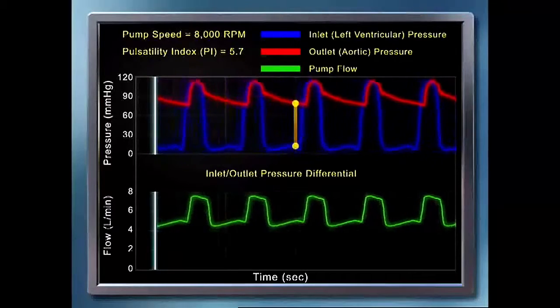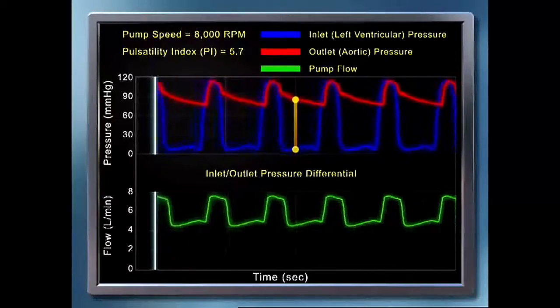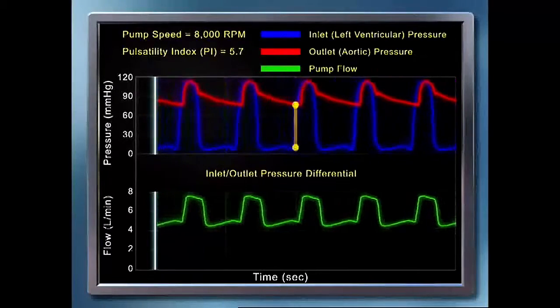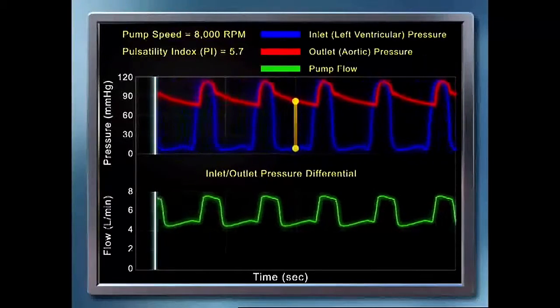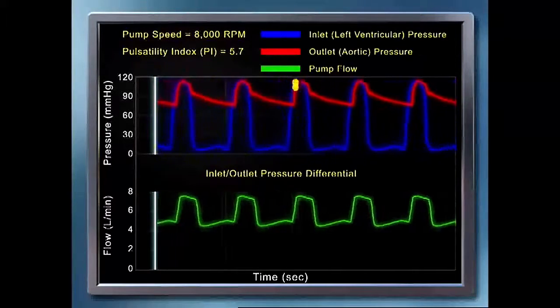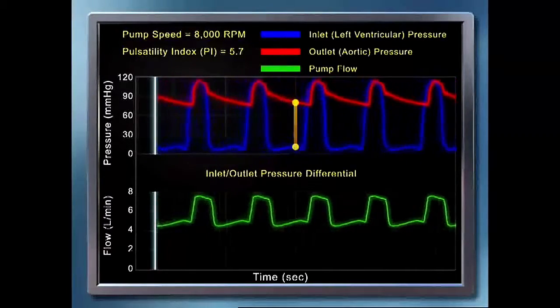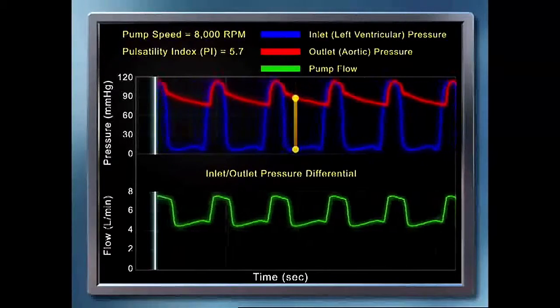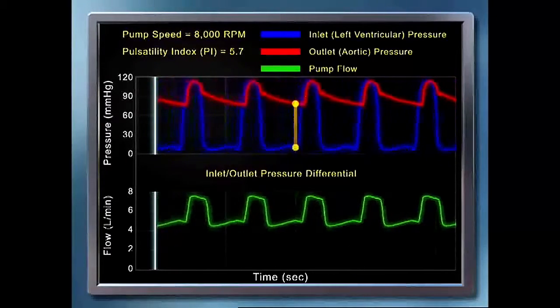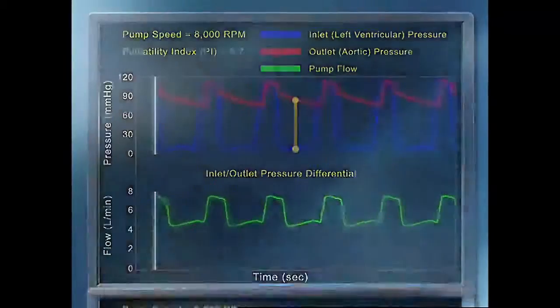A parameter that can be used to describe the magnitude of pulsatile flow across the pump, relating to the degree of ventricular contractility, is referred to as the pulsatility index, or PI. The higher the PI value, the greater the fluctuations in flow over the cardiac cycle. In this example at 8,000 RPM, the PI is 5.7.